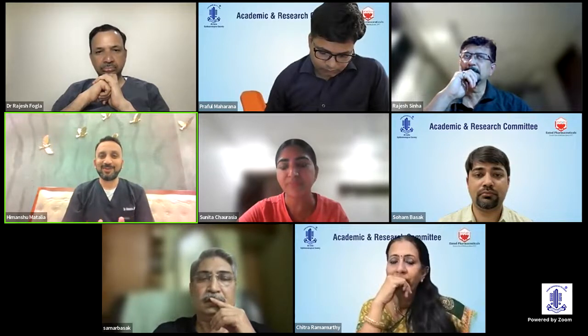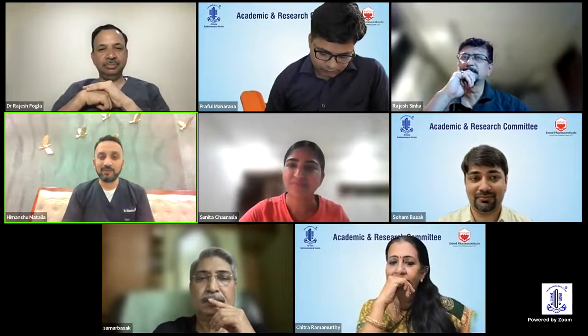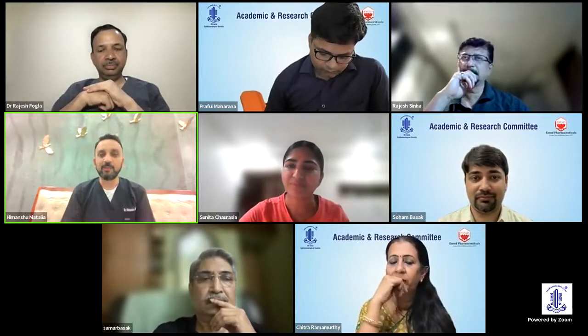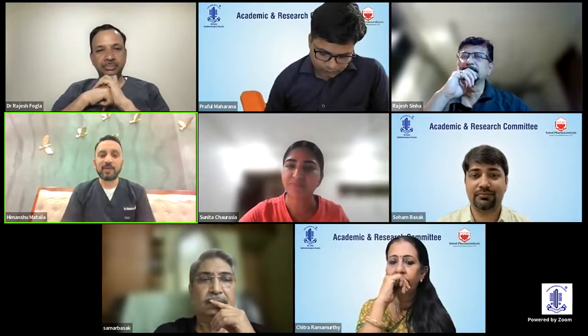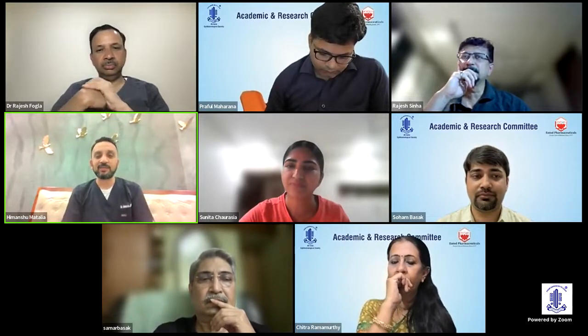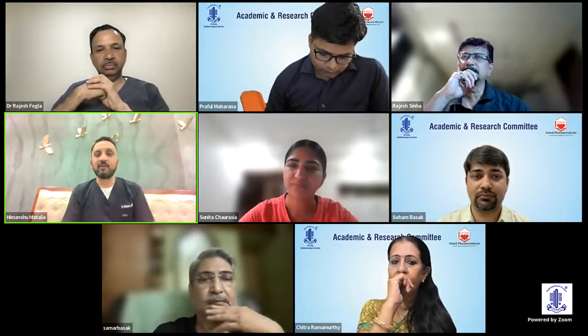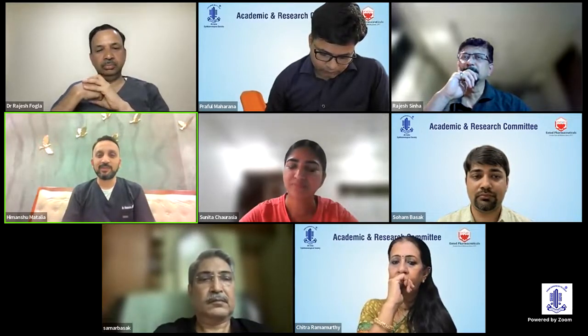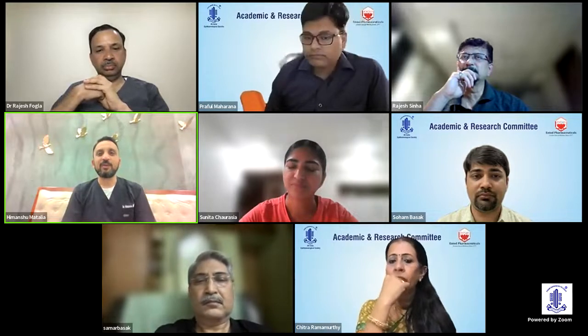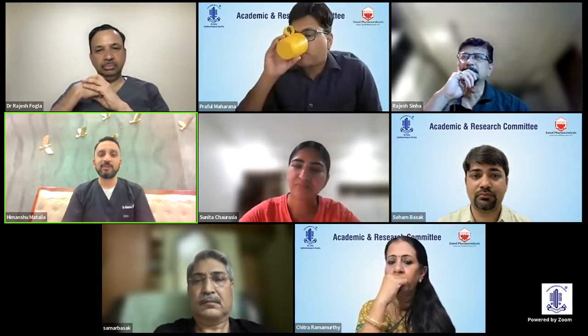Dr. Rajesh Fogla, I think we all have been a fan of you, and in fact, we have all learned from you. I've seen many small things which you do, which have a reason, which many times we don't even understand. One such thing was you not decompressing the anterior chamber before. Can you tell us why you do that, and what's the logic behind it?